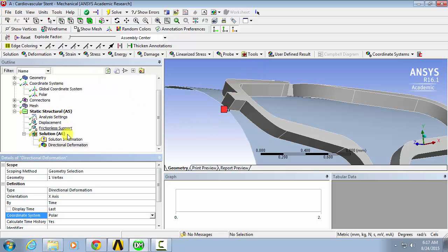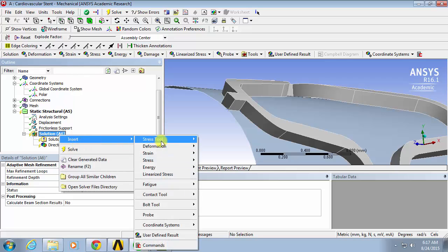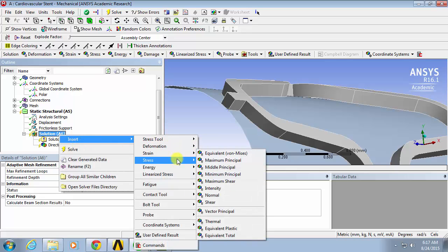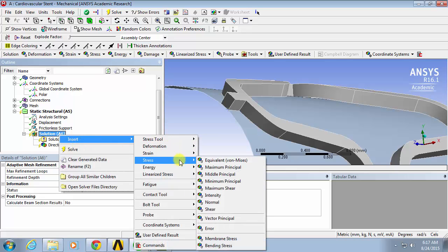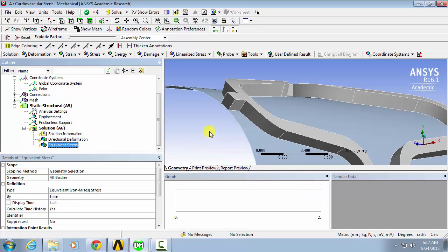Then, to get the stresses, we'll right-click insert equivalent von Mises stress and leave this for all bodies. Mostly, we're interested in the stresses inside the stent.